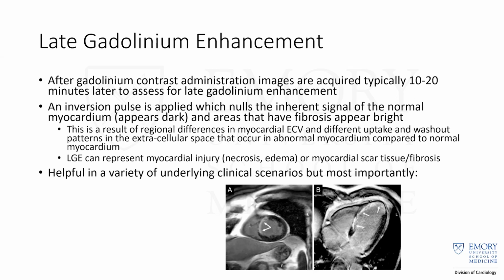It's helpful in pretty much every case that we do, but most specifically the times that we're looking for it are in MI, myocarditis, cardiac sarcoid, cardiac amyloid, and hypertrophic cardiomyopathy.